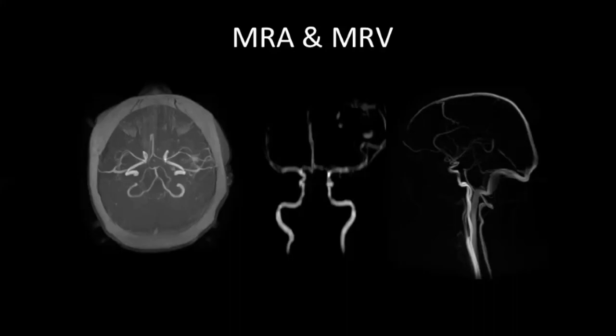This is the MRA and MRV of the patient. Can you appreciate something? Yes, ma'am. The first image is from MRA and it shows a normal posterior circulation. However, the middle cerebral artery on the left side, in the last image, I can also appreciate some arteriovenous malformations.